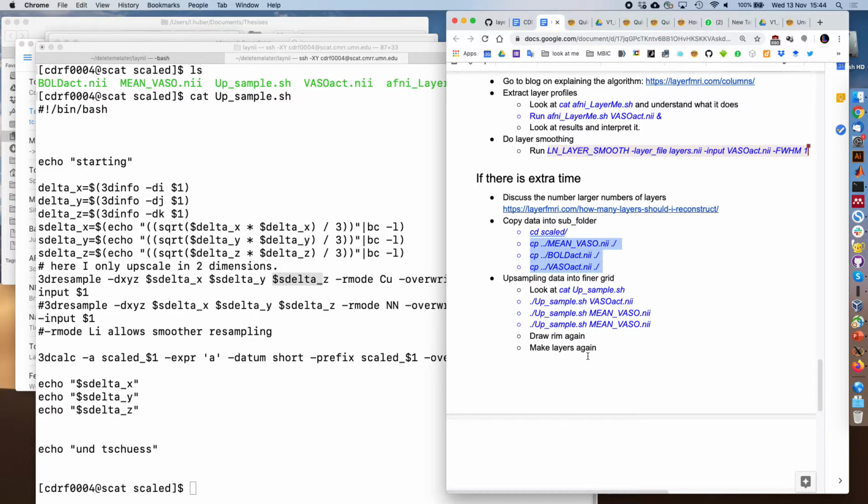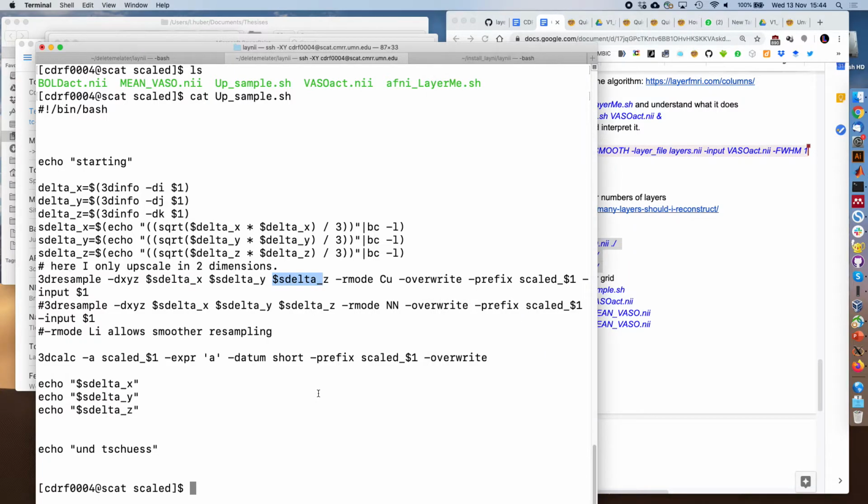I think the problem is basically what is finite in one domain, the support that is finite in one dimension and the other one. So if you do the sinc interpolation really in image space, you would have a finite kernel size. Whereas if you do it in k-space with zero filling, then you really have a finite rectangle in which you multiply the k-space data, and the rest is zero, which would be an infinite thing in image space. Just decide where your interpolation is.